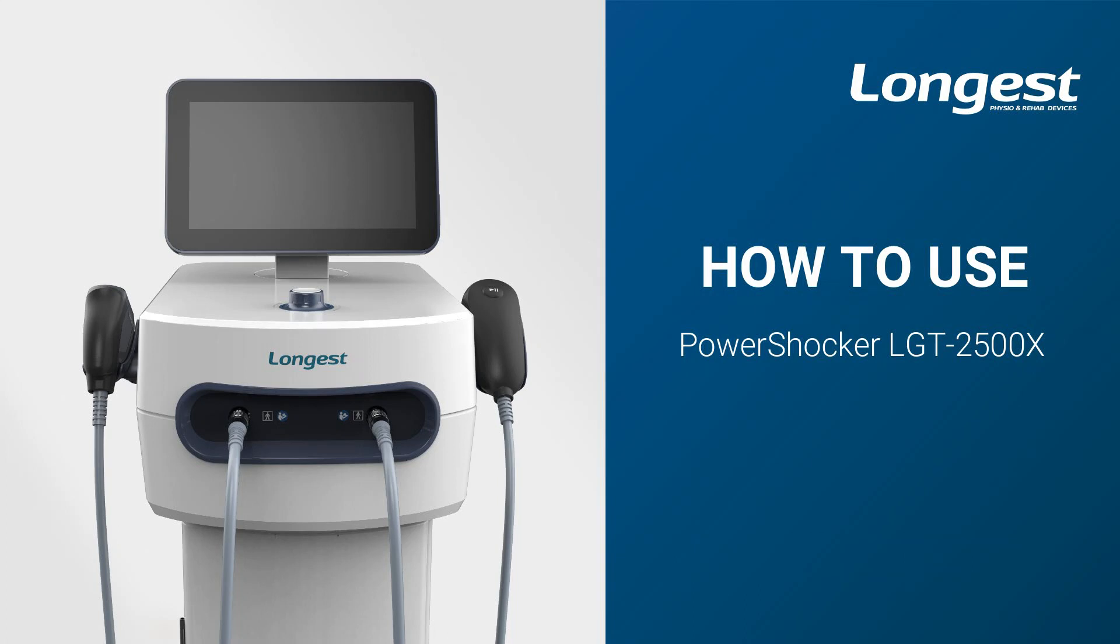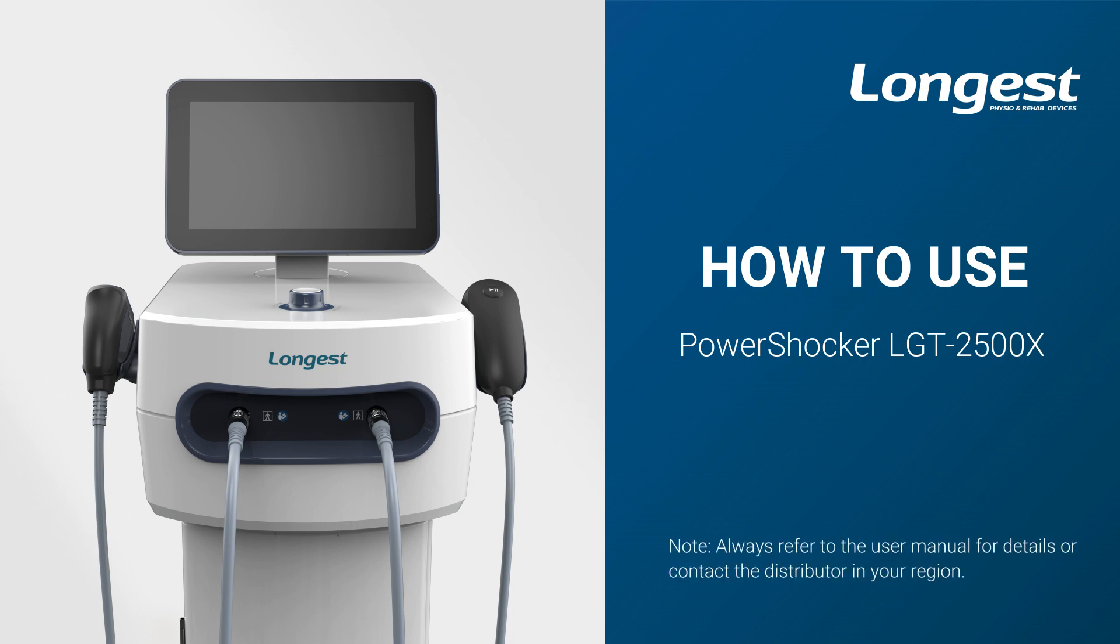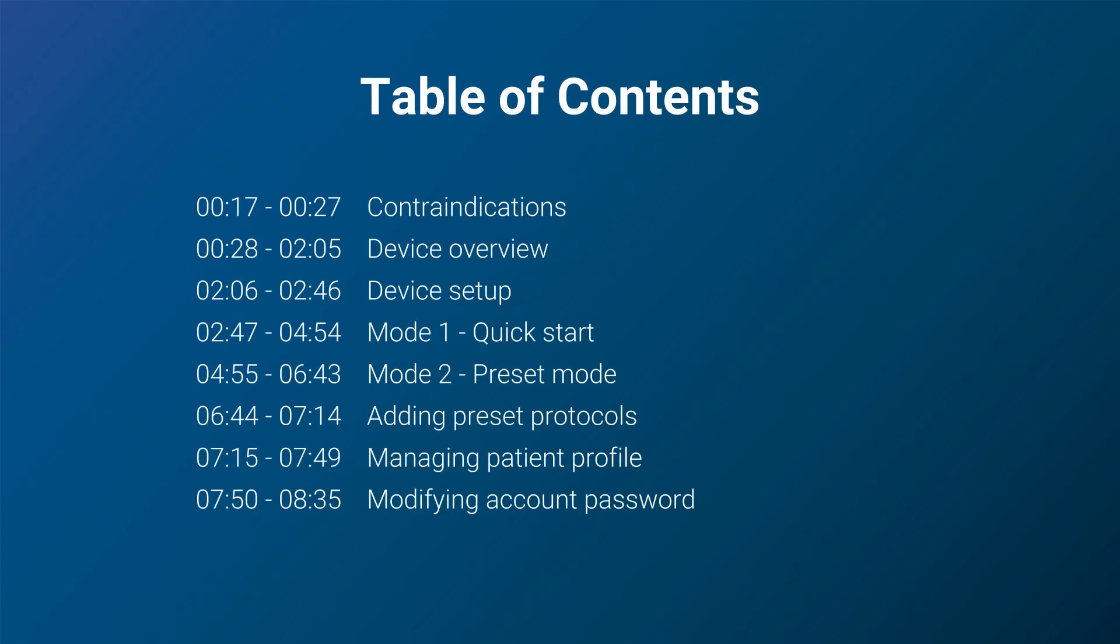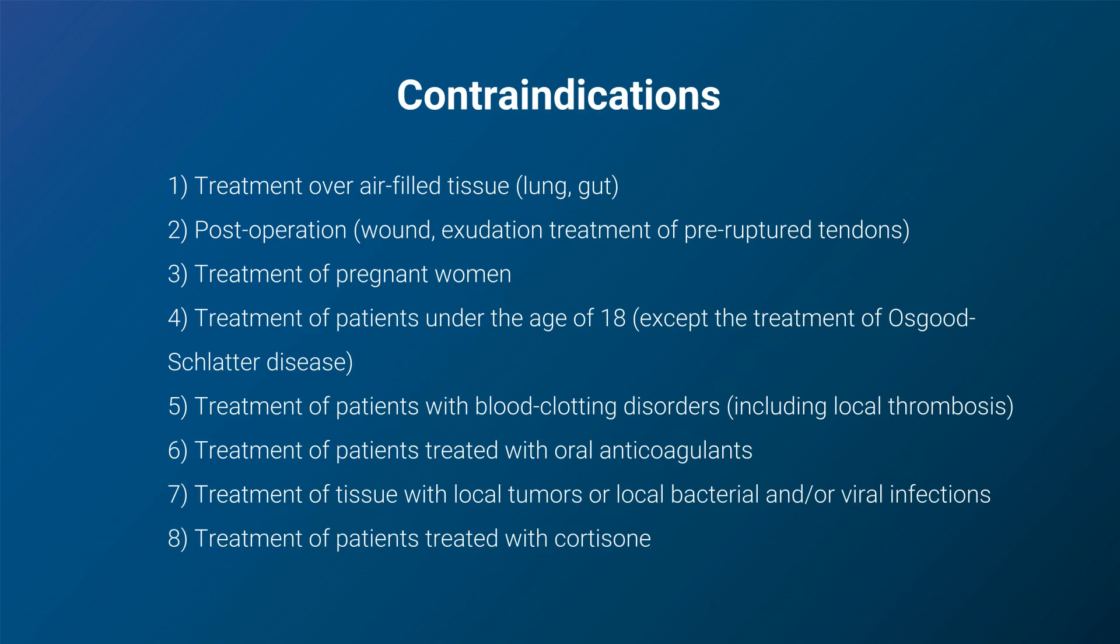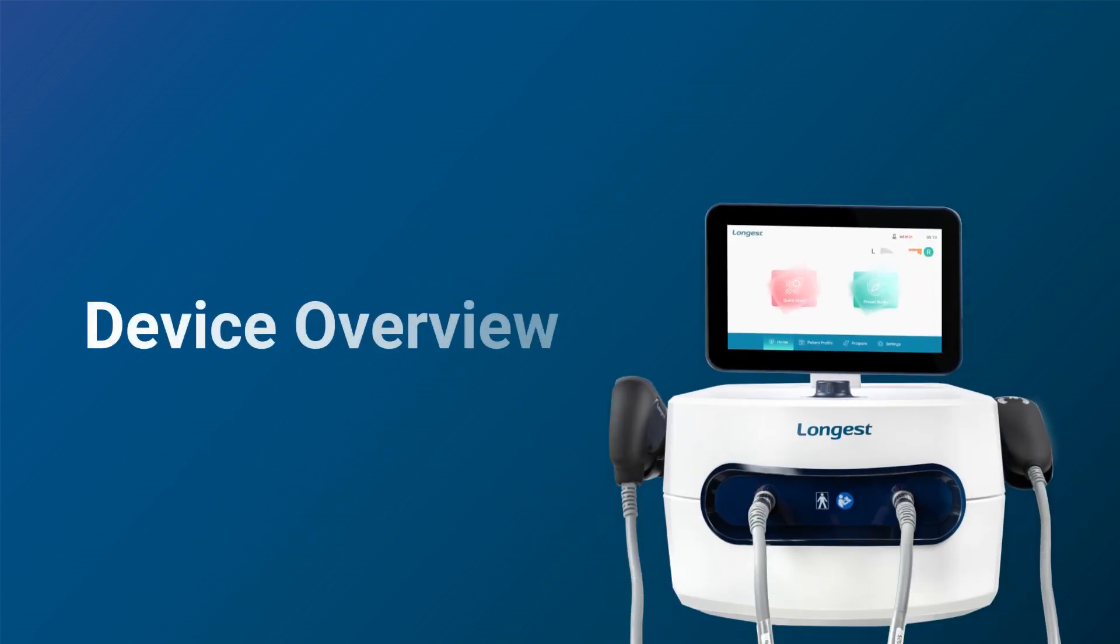Welcome to our new Shockwave Therapy Device Power Shocker LGT2500X Operation Demonstration Video. Please always refer to the user manual for details or contact the local distributor. In this video, we will guide you through the proper operation of this device. Shockwave therapy is non-invasive and generally considered safe and well-tolerated, but there are certain contraindications in which the treatment should not be used.